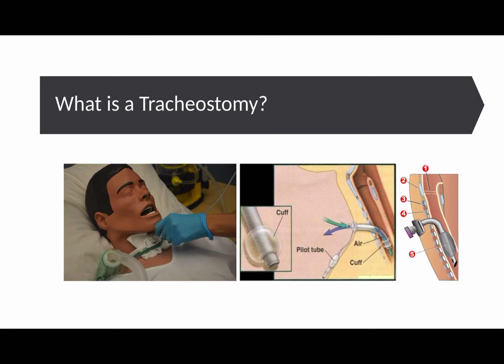The important thing to look at here is how short the tracheostomy is, and therefore there's a lot less dead space. Also, because you're not breathing through a longer tube, there's a lot less resistance, and so patients can spontaneously breathe through these, depending upon the size of it.